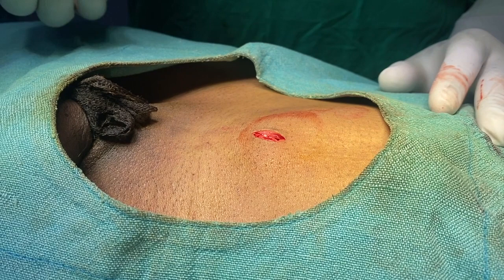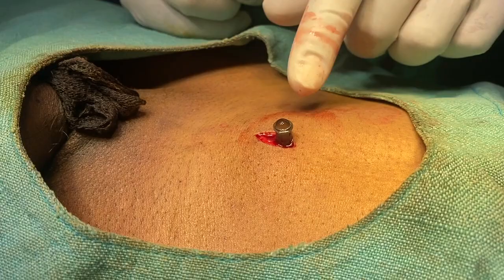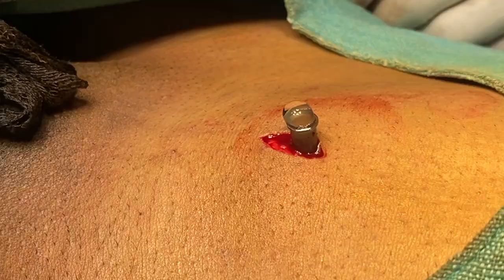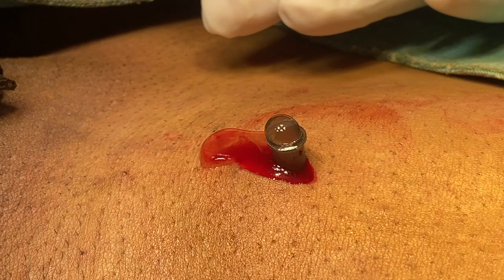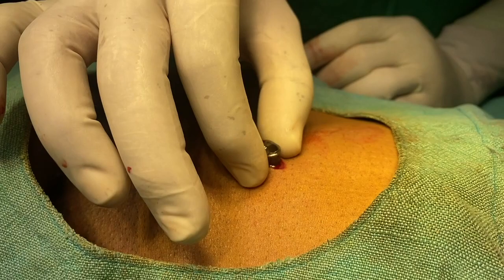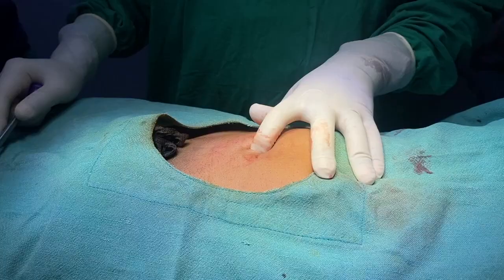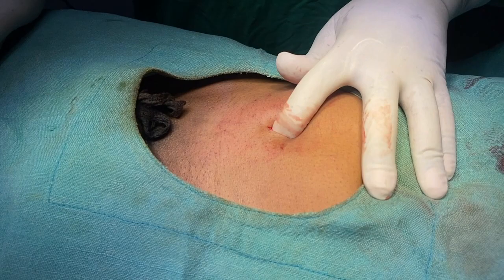Another important step before you do a suprapubic cystostomy is a diagnostic tap, done with a needle. The needle goes in vertically — and you can see the urine coming. Unless you get a good diagnostic tap, you should not be putting in the trocar. This also helps in diagnosing the color of the urine and assessing the depth required, so we have confirmed that urine is present.